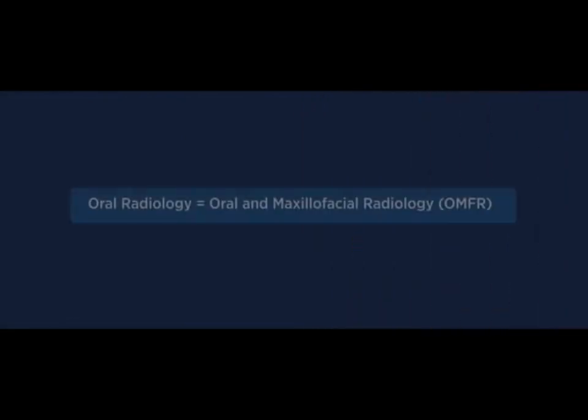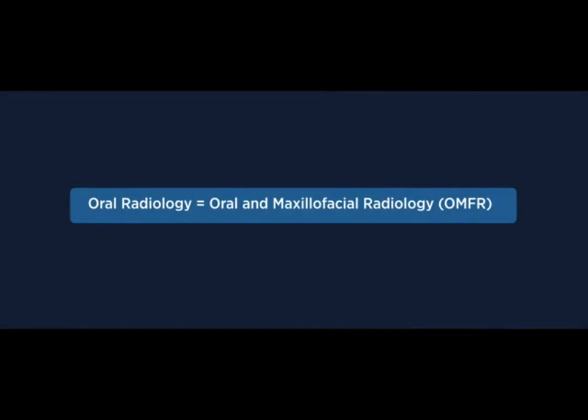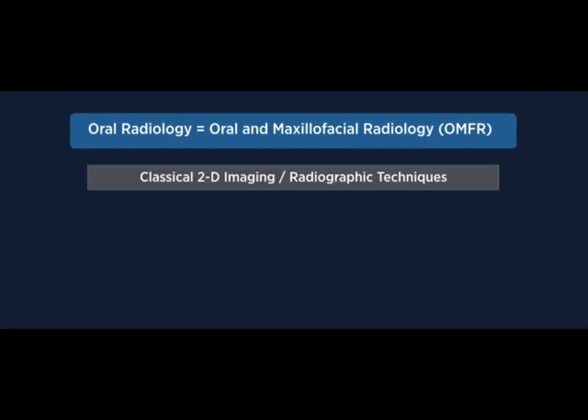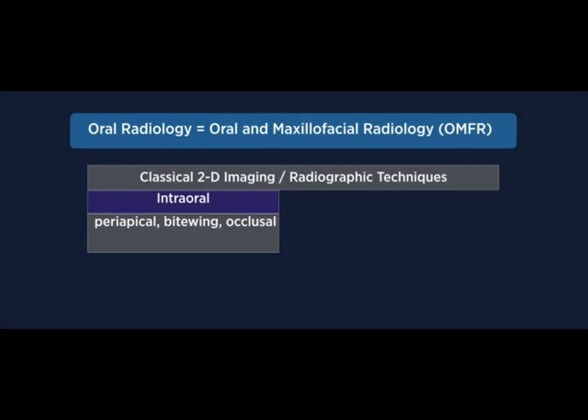Oral radiology actually is called oral and maxillofacial radiology, which is the professional term, OMFR. But for practicability, it's also referred to as oral radiology. Oral radiology includes extra and intraoral radiographic techniques. And I want to show you and define some of these in more detail. Classical intraoral techniques are periapicals, bite wing, and occlusals.